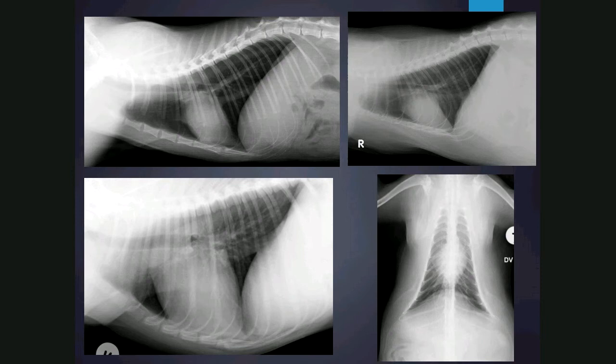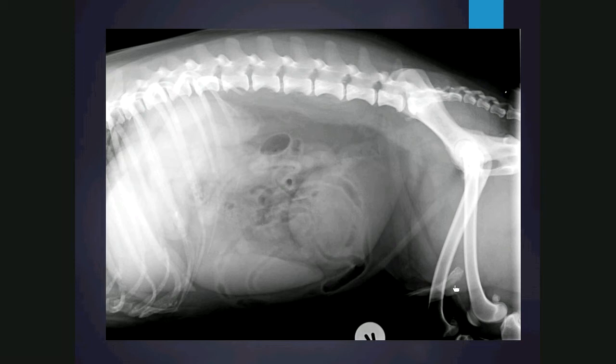In this lateral view of the abdomen, there are two things that tell us it is a male canine: the presence of the os penis, and a round soft tissue structure in the caudal abdomen which is the prostate. Note how this patient is skeletally mature because we don't see any radiolucent open physis in areas where we might expect them in a younger animal.